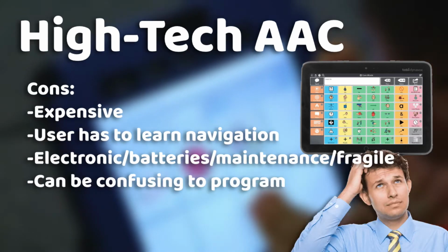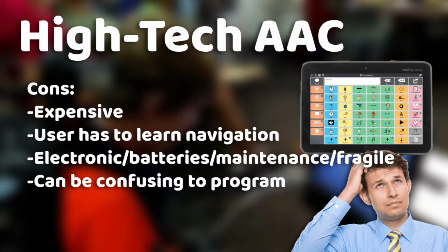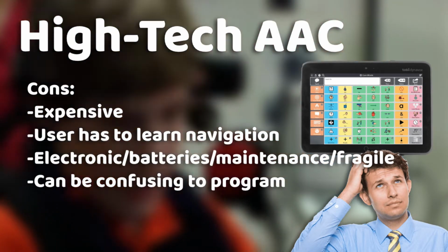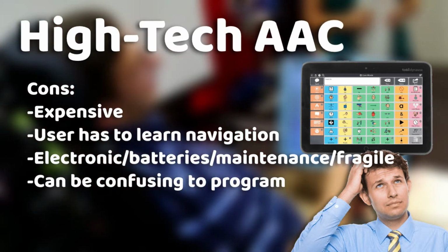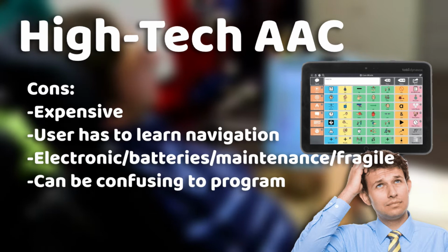The cons of AAC devices that are high-tech are that they are expensive. There are some cheaper apps out there with limited applications, but usually the quality apps start at around $50 for a tablet, and if you're getting it on a computer, it can be a few $100s, and devices, especially those with eye control and head control, can run in the thousands of dollars.